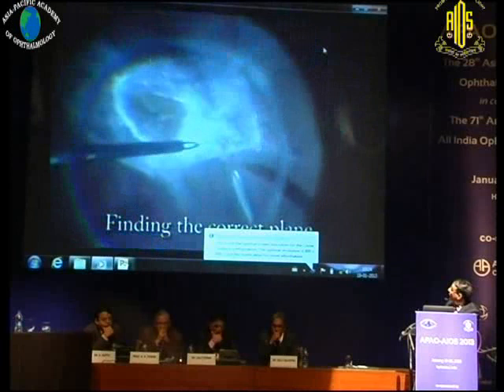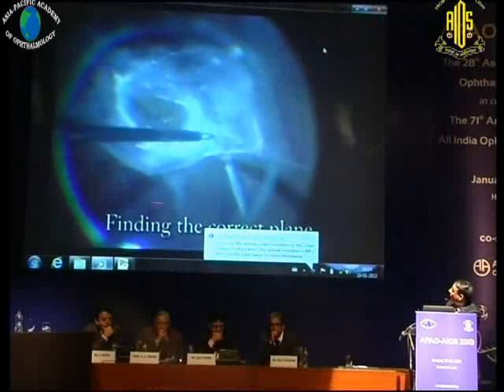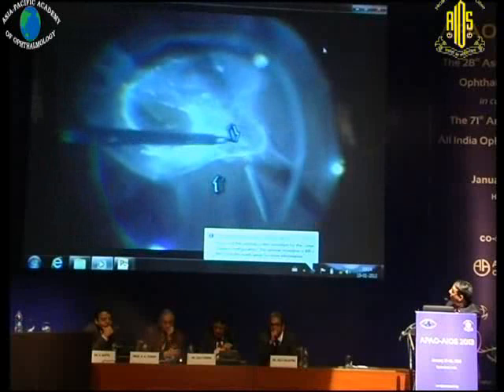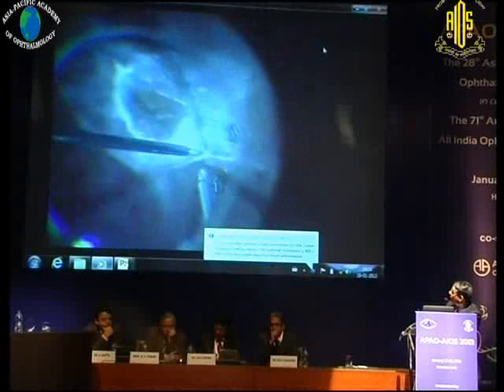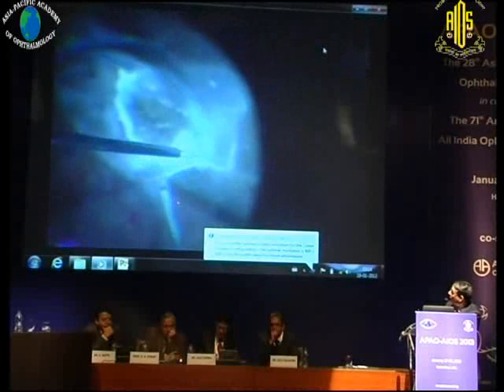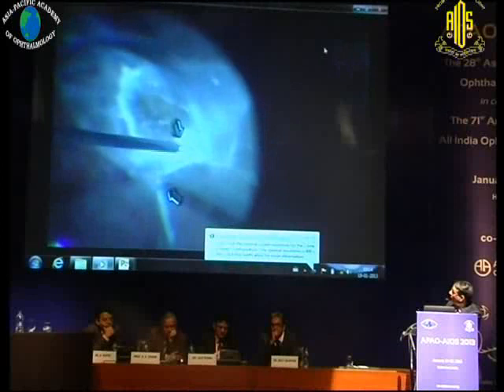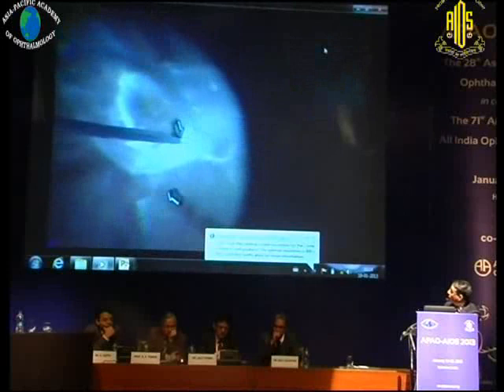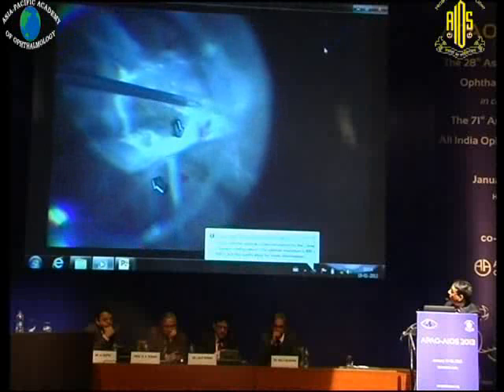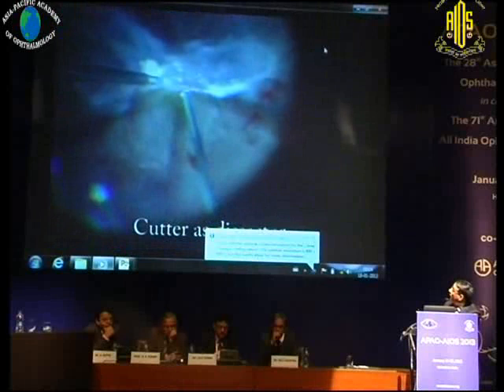This is a full-blown classic tabletop traction detachment — an advanced TRD. The key is finding the correct plane. This apparently seems to be the edge, but it's not — the hyaloid is extending further anteriorly along this region, and you have to get into the correct plane there. Once you're in the correct plane, the dissection proceeds much more effortlessly and quickly, and you can see each point of connection between the membrane and the retina and then proceed further.